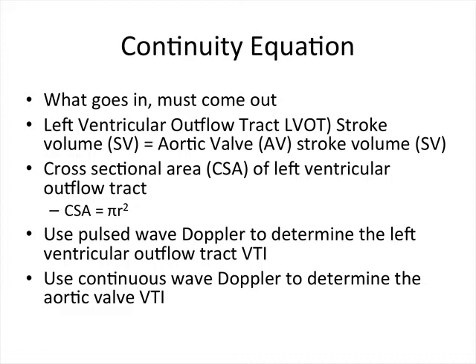Continuous wave Doppler is used to sample the volume at the point of highest velocity within the left ventricular outflow tract and aorta, which in patients with aortic stenosis should be at the level of the stenotic aortic valve. Again, the velocity profile is traced to measure the aortic valve VTI.